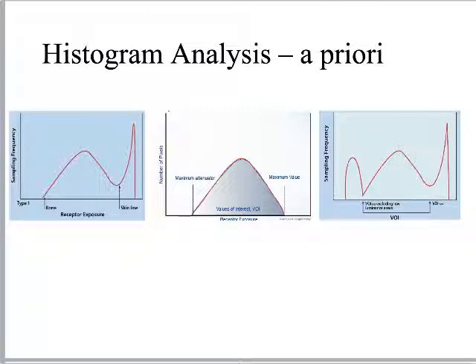The thing is, though, we have to tell the computer what we are hoping the thing to look like. I've talked a lot about this model A. The textbook doesn't define it yet in this chapter, but it will eventually. The thing that I'm talking about when I talk about model A, in the world of X-ray, we would call a lookup table, L-U-T, lookup table.